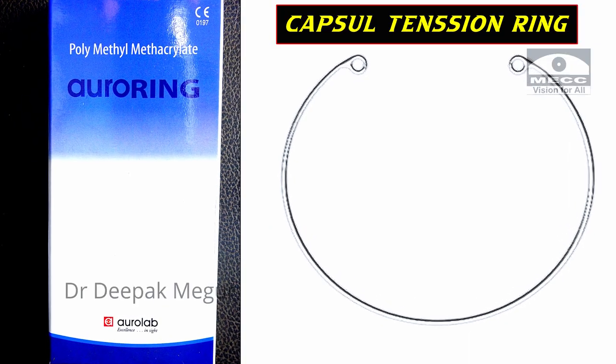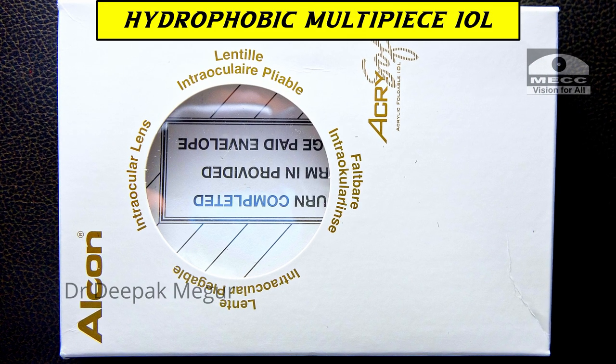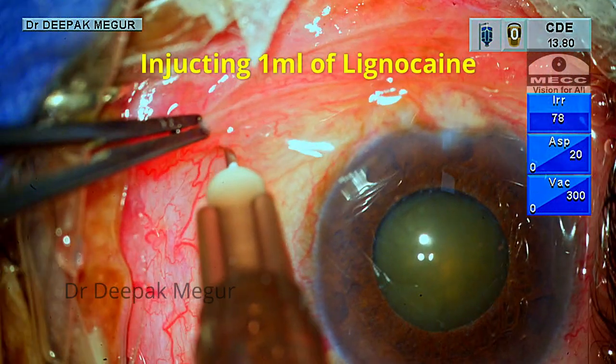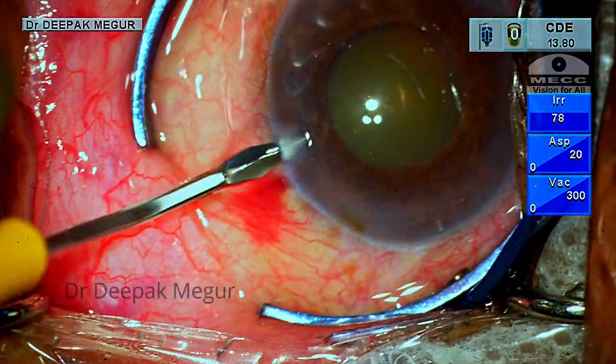I am ready with my CTR and a hydrophobic multi-piece IOL for the IOL trap technique. I am injecting 1 ml of lignocaine subconjunctivally, anticipating a slightly long surgery, just to keep the patient comfortable.